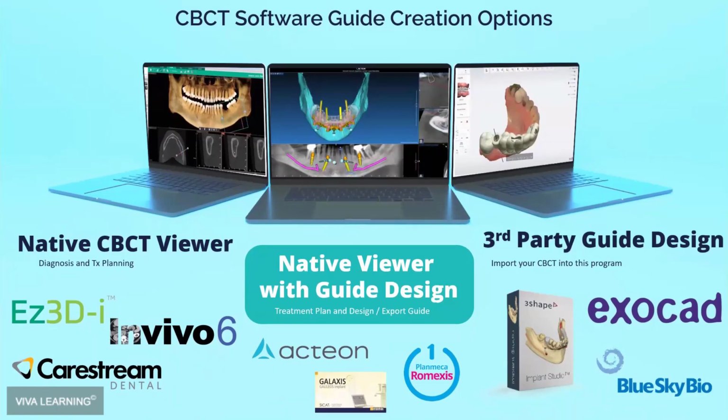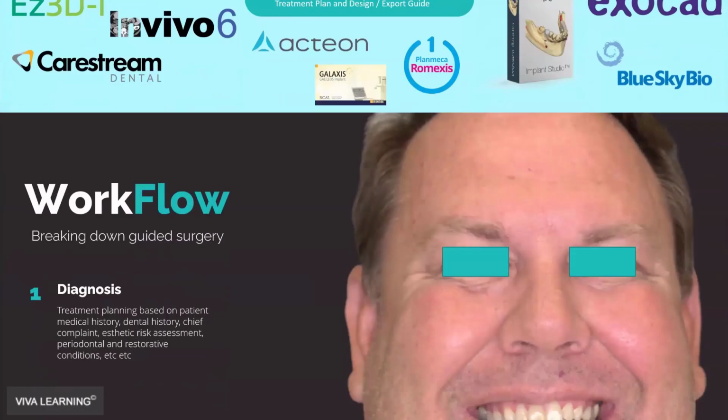Some of those are lab tools more often than not, but these are things where you have to take your CT DICOM out of your machine and re-import it into that software. So it's nice when you can be in the middle there and have one software that does all of it, instead of having a CareStream where you have to export the DICOM and re-import it into some other software to actually utilize it.